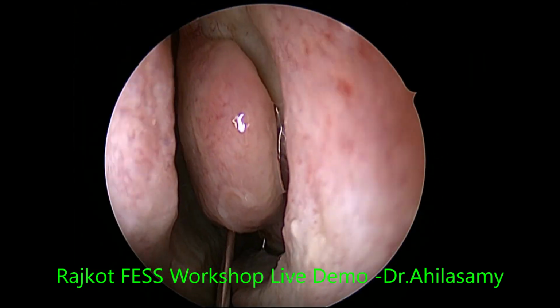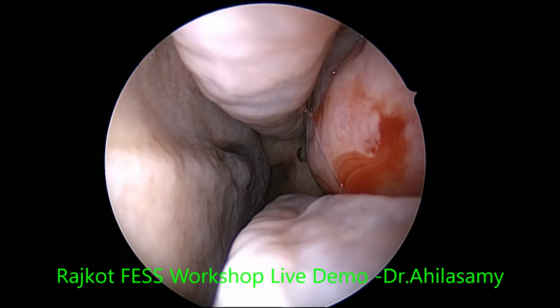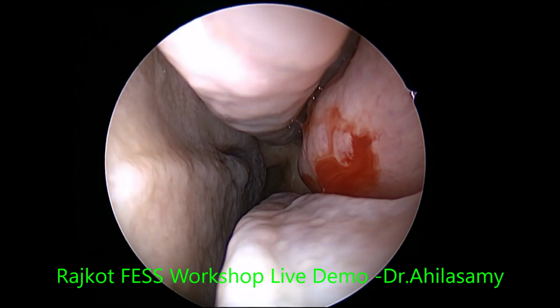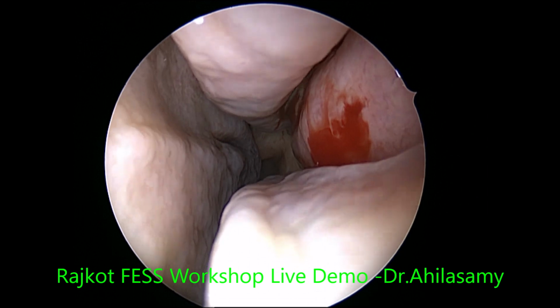See, it's the posterior part of the bulla I'm giving, because the exact sphenopalatine area is not properly seen, so I am giving a little blindly. The infiltrated fluid will spread there.